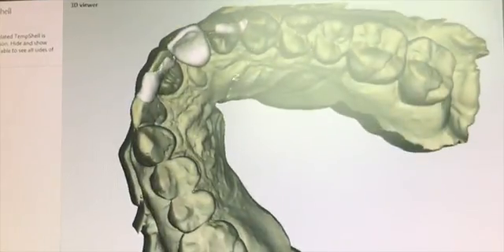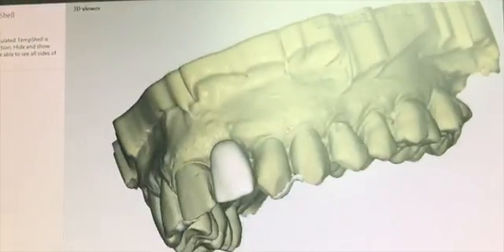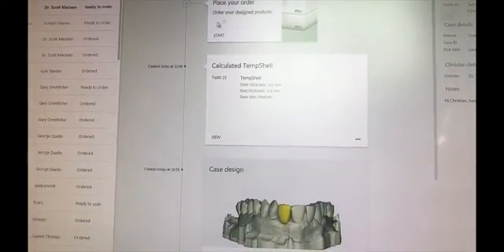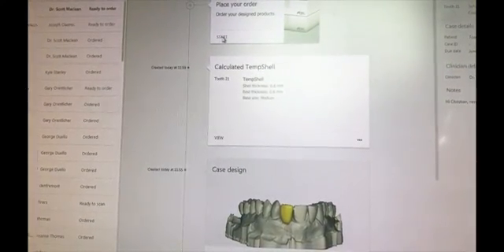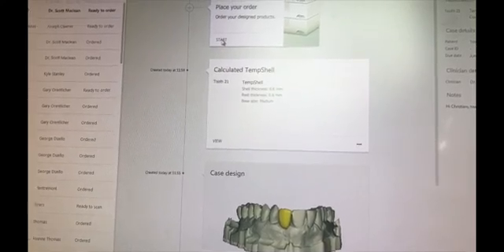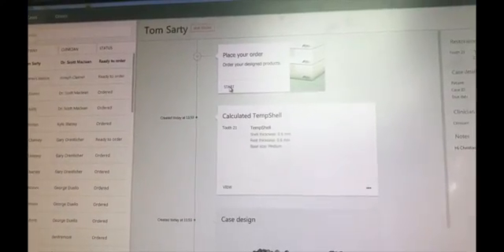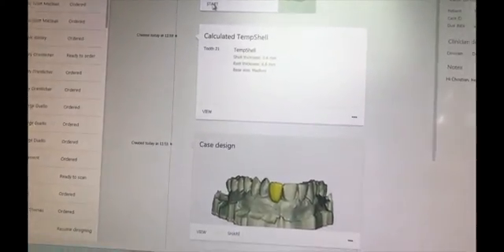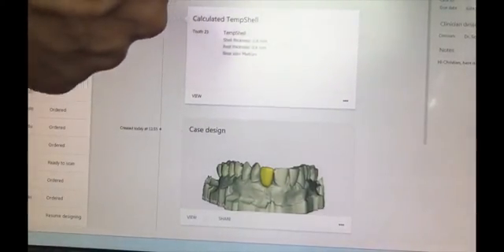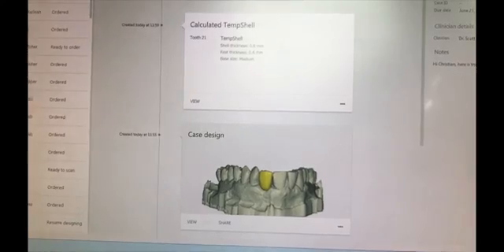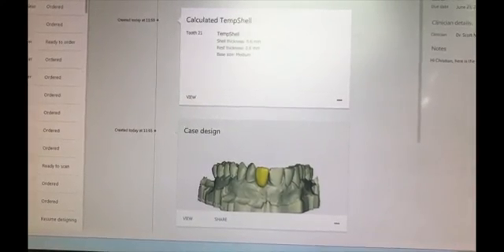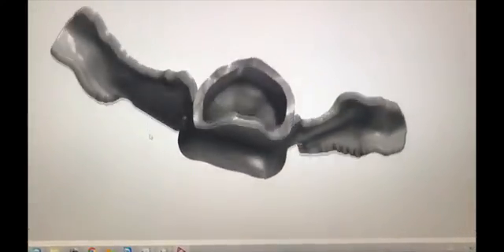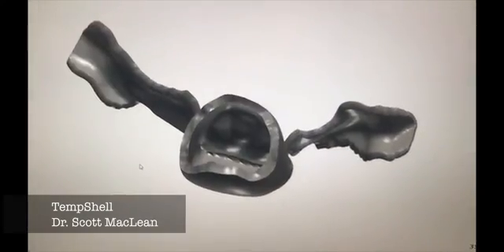We know where the access is going to be in the labial of this temp shell, and we'll know the position based on occlusion. The lab will then request an STL print file, and this print or mill file will be used to fabricate the temp shell in their own dental lab locally — not sending it to Nobel Biocare. This high-resolution file is generated so they can either mill or print the temp shell.